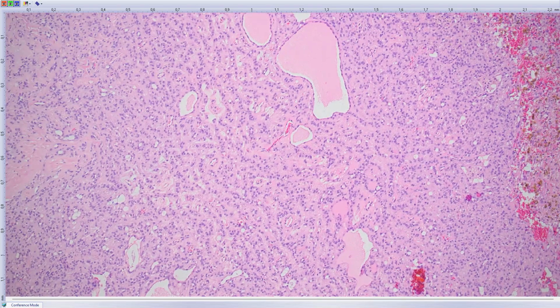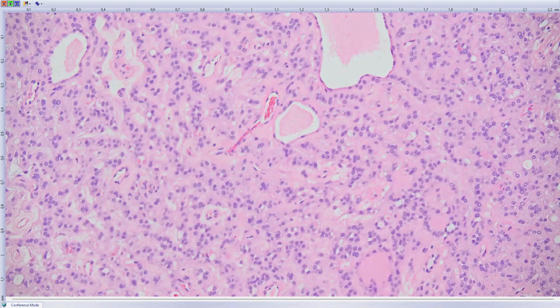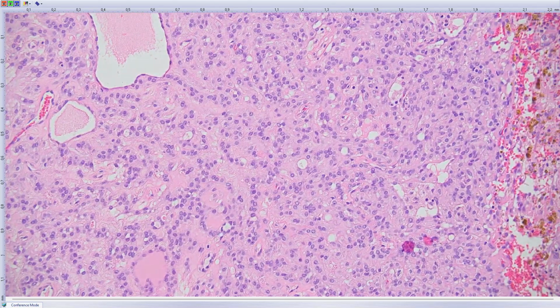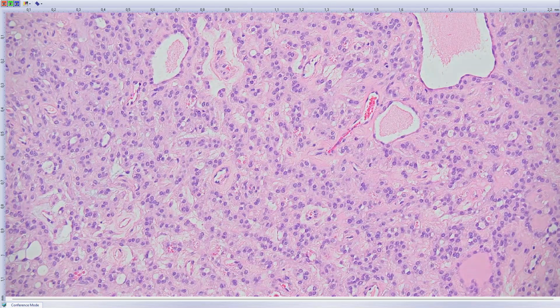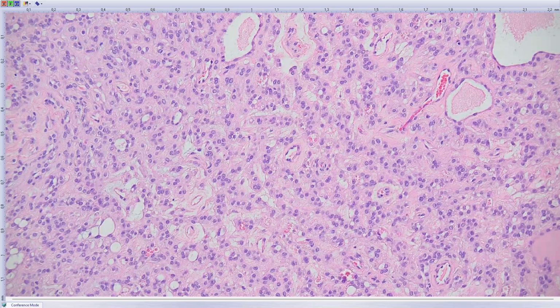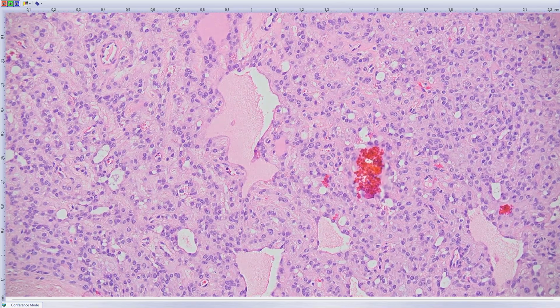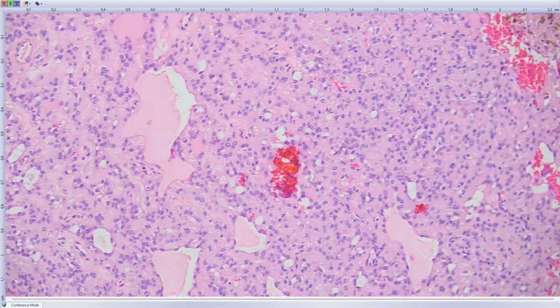is again the same or very similar to the small tumors, and we can also see some signet ring cells here. So we again think that this tumor, despite looking a little bit different from the small signet ring cell tumor, is part of the same spectrum.